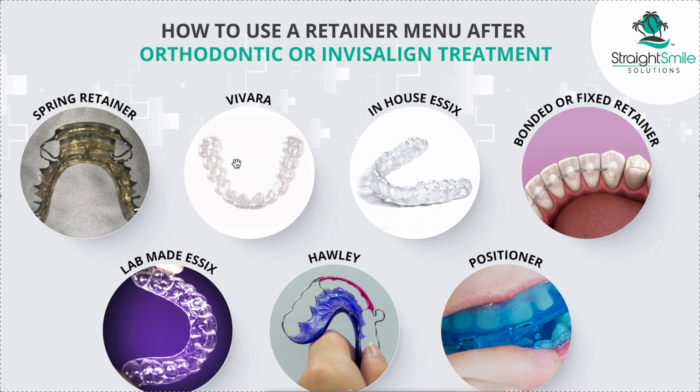And they also store that STL or that final setup for quite a lot of time. I don't know exactly. I think it's about 5 years. You can ask them. So if you ever need to remake within that period of time, you just click a button and they will make more. So that's really, really nice, okay? So same benefits, but it's only sold in packs of 4 uppers, 4 lowers. Lab fee right now, at least in the US, is around $300-ish plus shipping. It might be a little higher where you're from. That's a total of 8 retainers. So that's pretty reasonable if you do the math.